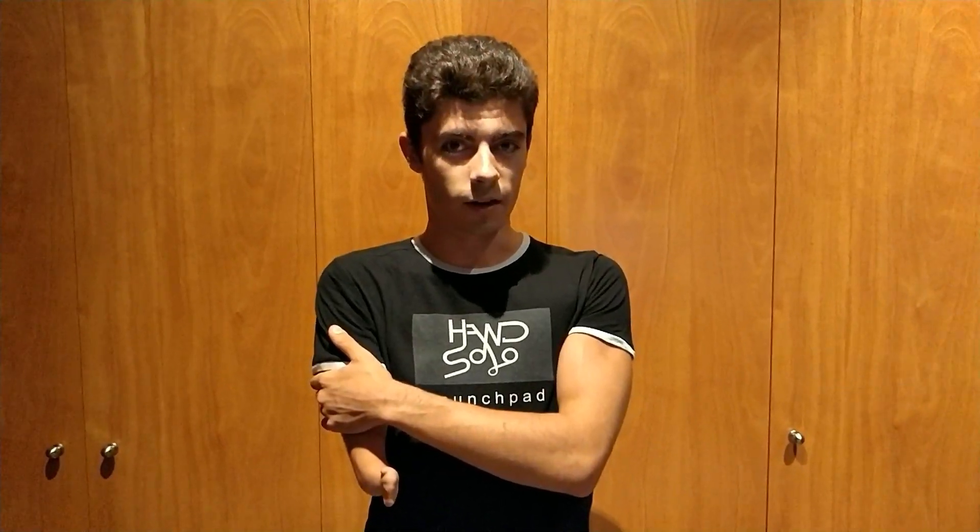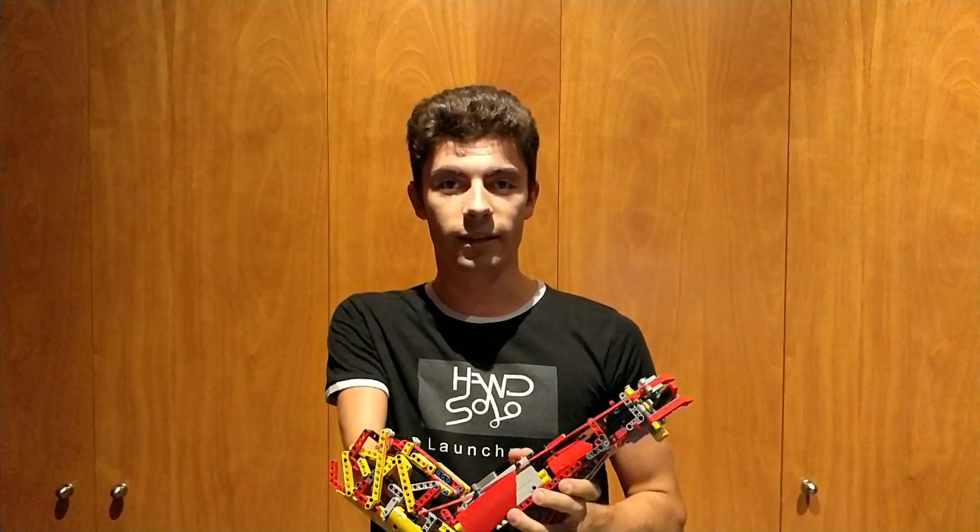Hello there! My name is David Aguilar. As you saw in my first videos, I built a prosthetic out of Lego.